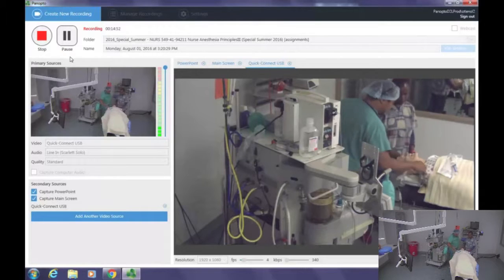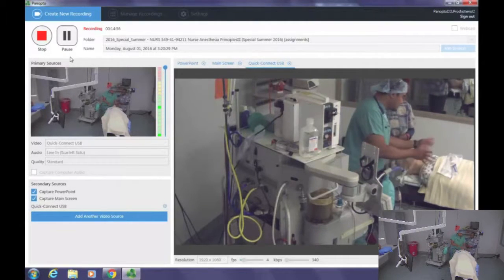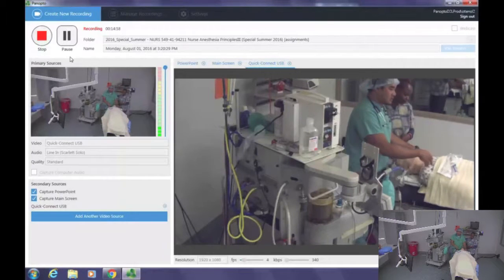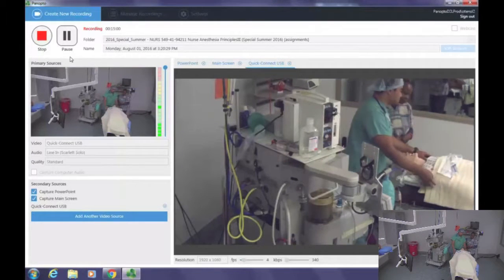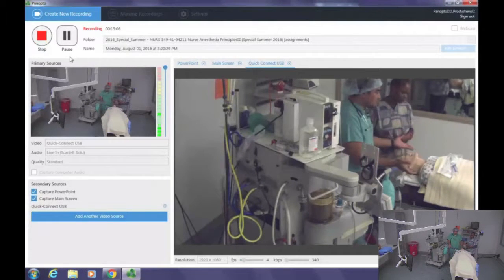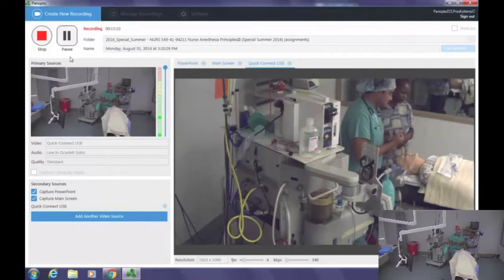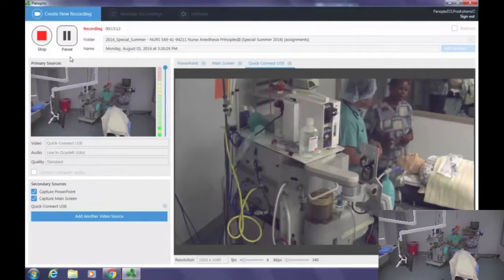First of all, once the patient is on the table, we're going to hook up the monitor. We're going to hook up the blood pressure cuff and tell the patient that it's going to be tight initially. And then we're going to put on the pulse oximeter. The pulse oximeter is the first one, sorry.